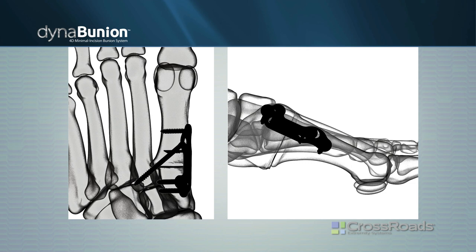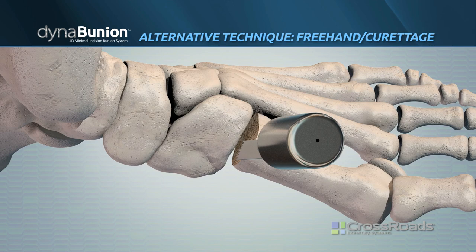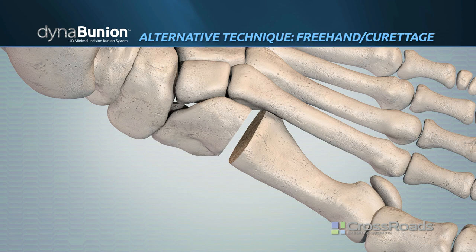This portion of the technique is only for users who wish to perform the curettage technique or wish to complete their cuts freehand without a cut guide. Complete the metatarsal and cuneiform cut freehand or perform the curettage technique.